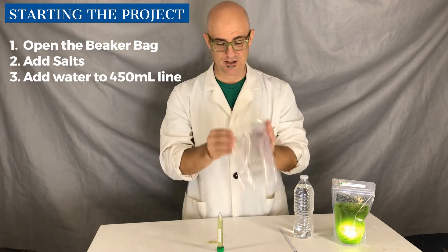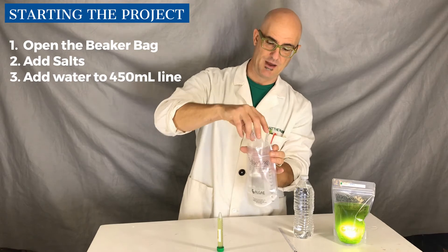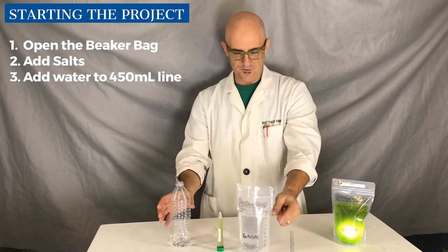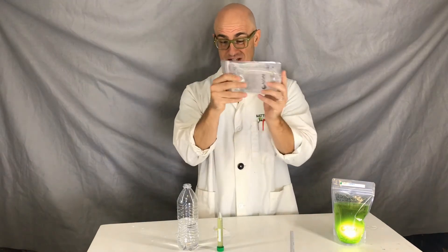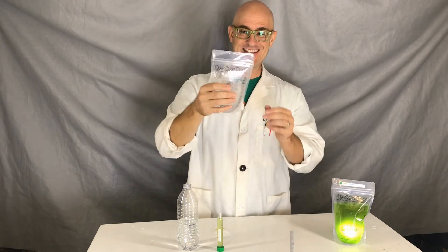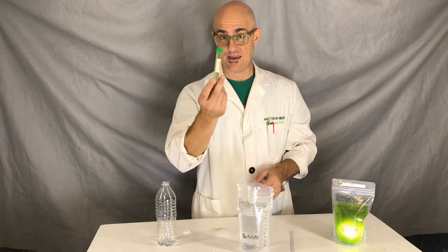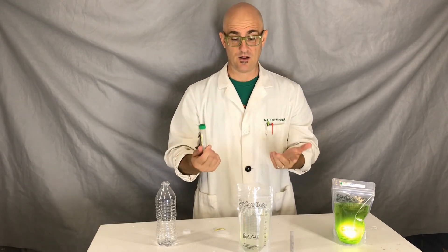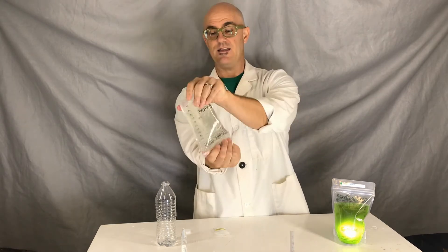Let's pretend you just got the kit. You inflate your beaker bag. Next, take all of your salts and dump the whole thing into the bag. After you've added your salts, fill the water up to about 450 mils. We don't want to fill it all the way because when you seal it, it'll spill over. Then begin to shake it — the salt should dissolve pretty quickly. Although this top is pretty sealed, it's not a perfect seal like a ziploc. Next, add the algae culture that already has the nutrients in it. Mix it up a little bit to make sure everything is distributed.